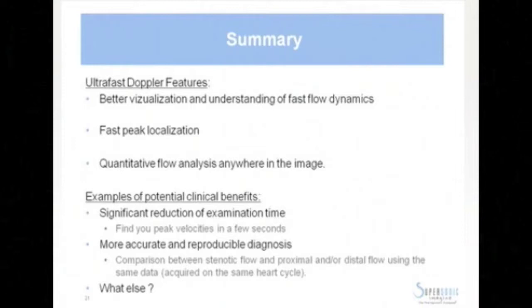So a few examples of potential clinical benefits of that. First, a reduction of the examination time, because sometimes it takes a lot of time to locate where the peak velocity is with conventional spectral data. A more accurate and reproducible diagnosis.